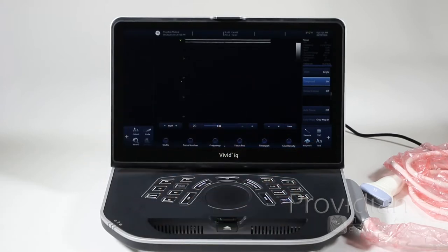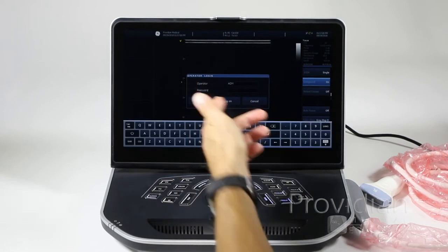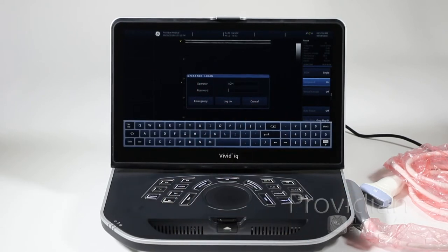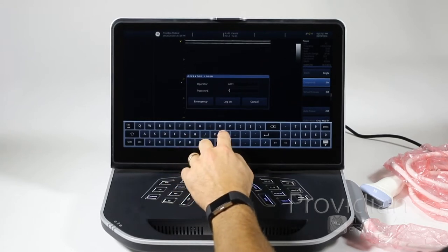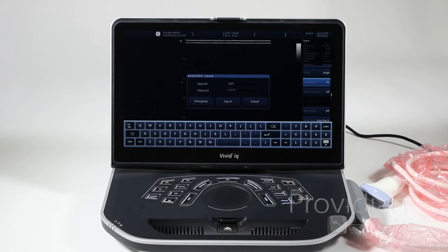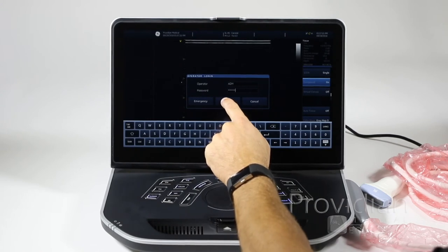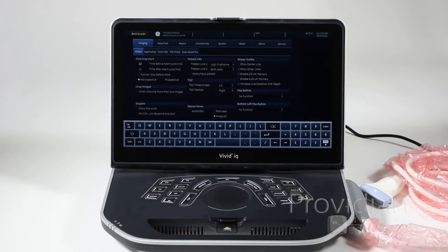Now you have your scanning screen. Another thing you might face on boot up is it might ask you for an operator login. To log in as administrator, ULSADM is the default password — which you can change, and we'll get to that in a later video. It's all lowercase: U-L-S-A-D-M. Log on and you're ready to go.